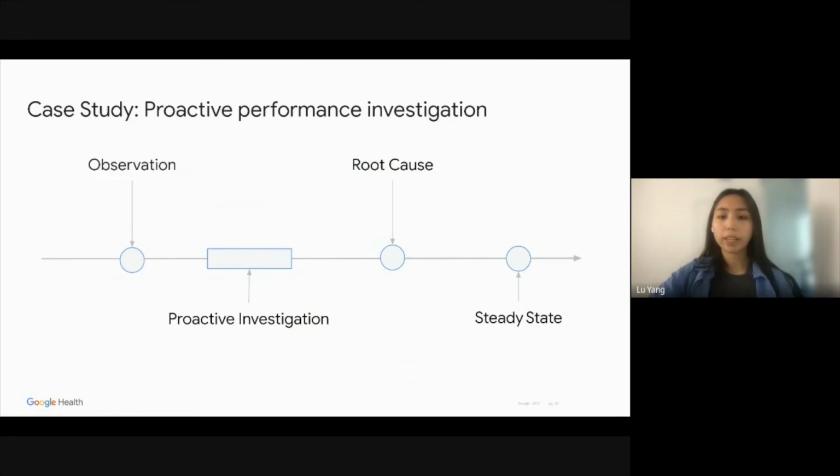Finally, we have a case study where we observe performance variation during site initialization. During site initialization, where we observe performance variation, there was limited customer feedback for ARDA related to performance. Once we noticed the performance variation from the dashboard that Anne was talking about before, we initiated investigation proactively, and we leveraged real-world evidence data to understand causes along with the site operator.